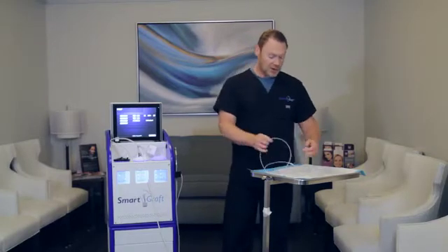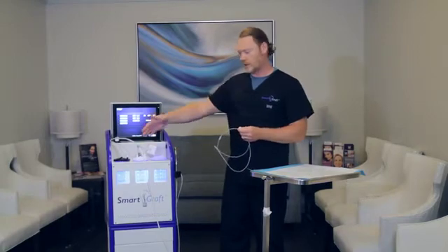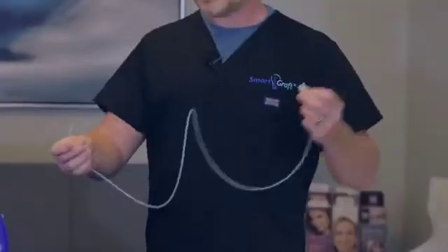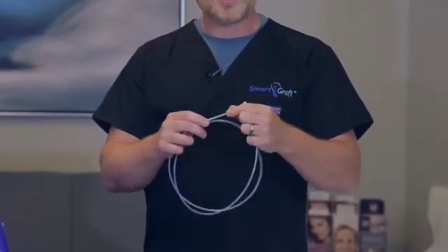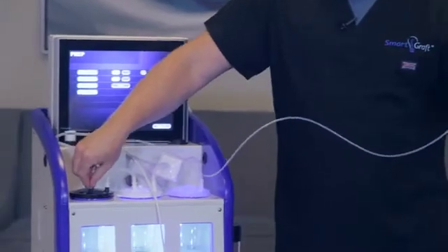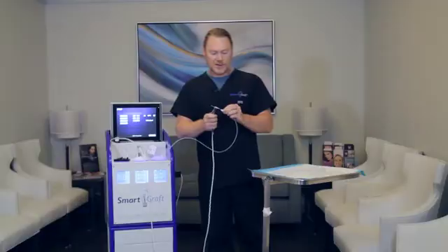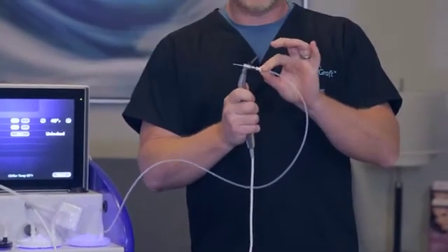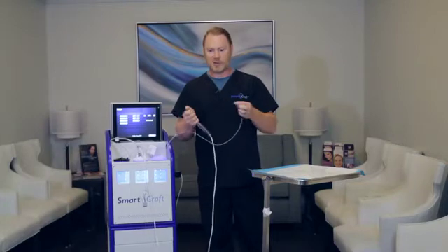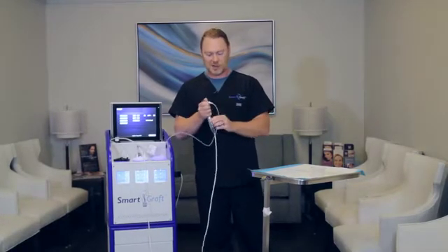The last tube is actually going to be the tube that the grafts come through from the handpiece into the graft canister. You'll notice there is a connector on one side and just basic tubing on the other side. This tubing will fit into the last hole position where the grafts will go into the basket, and this will connect right onto the back end of it and it is secure. If you want to take this off, you'll just have to pull it right off, but it does create a suction that holds it in place.